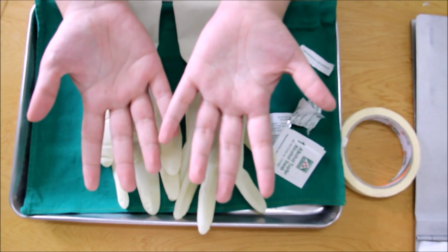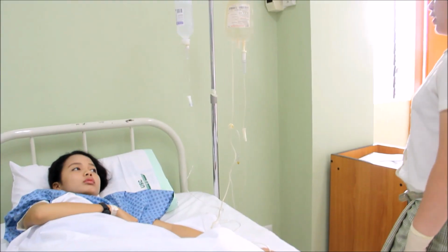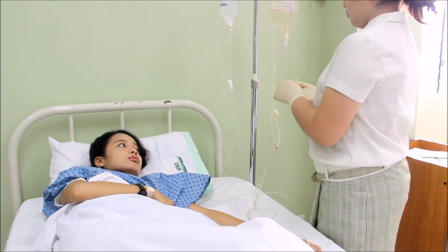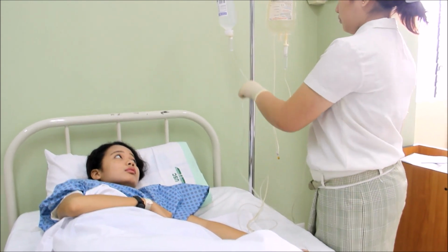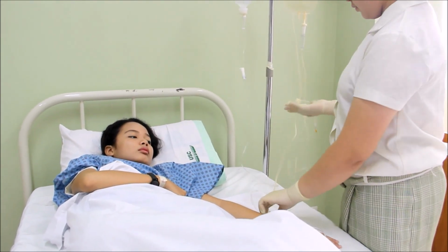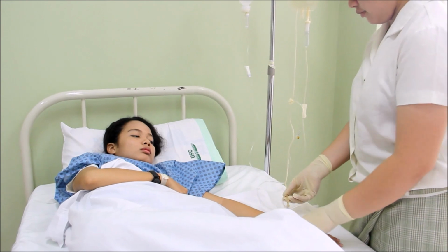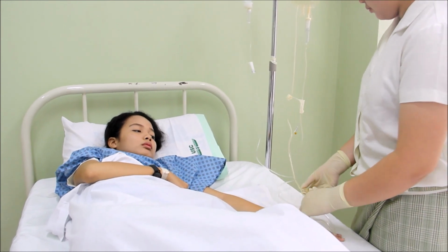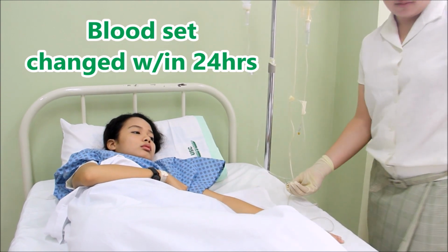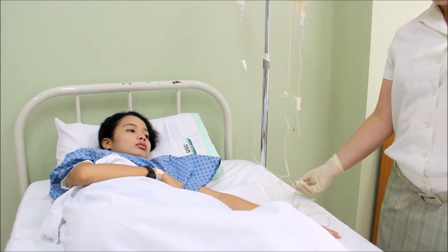Put on clean gloves. If no infusion is to follow, clamp the blood tubing and remove the needle. If another transfusion is to follow, clamp the blood tubing and open the saline infusion arm. Blood administration sets are changed within 24 hours or after 4 to 6 units of blood per agency protocol.